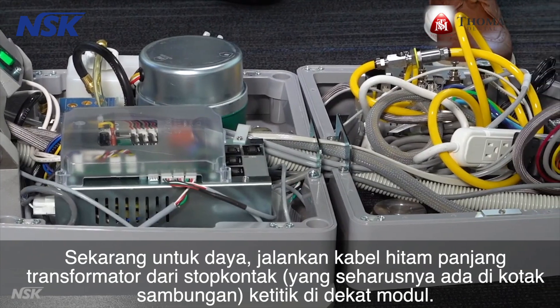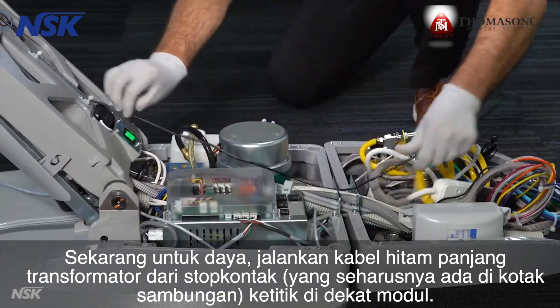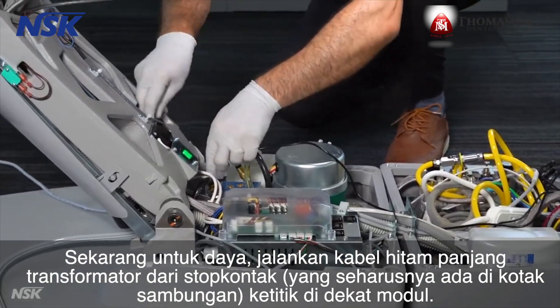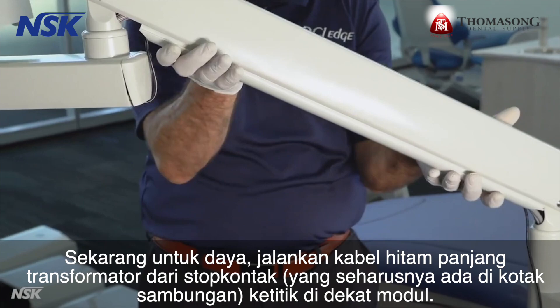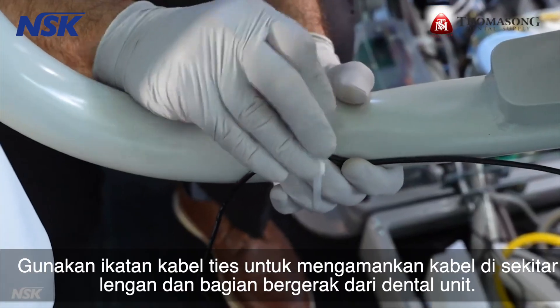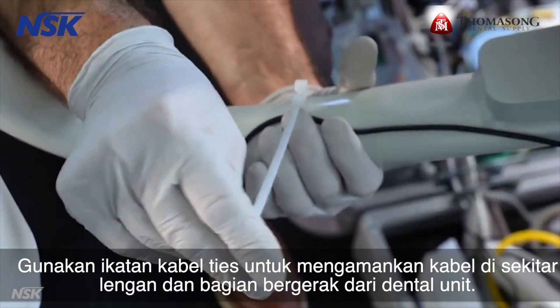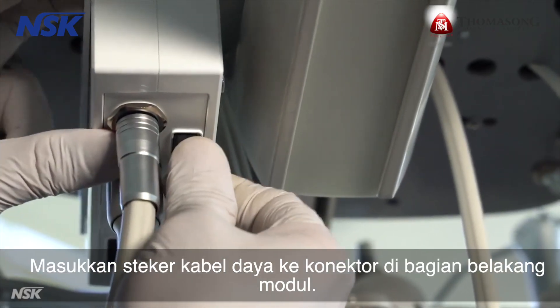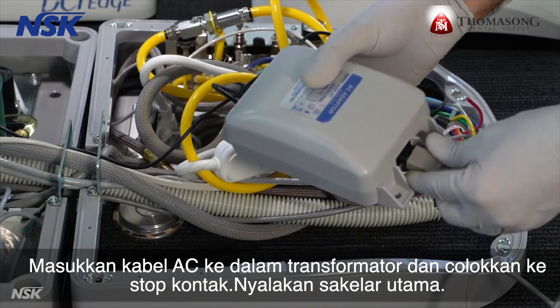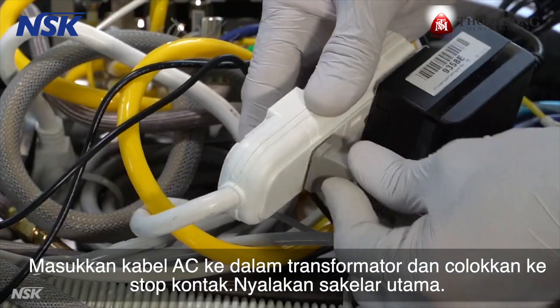For the power, run the long black cord of the transformer all the way from the power outlet, which should be in the junction box, to a point near the module. Use zip ties to secure the cord around the arms and moving frame of the delivery unit. Insert the power cord plug into the connector at the back of the module. Insert the AC cord into the transformer and plug it into the outlet.